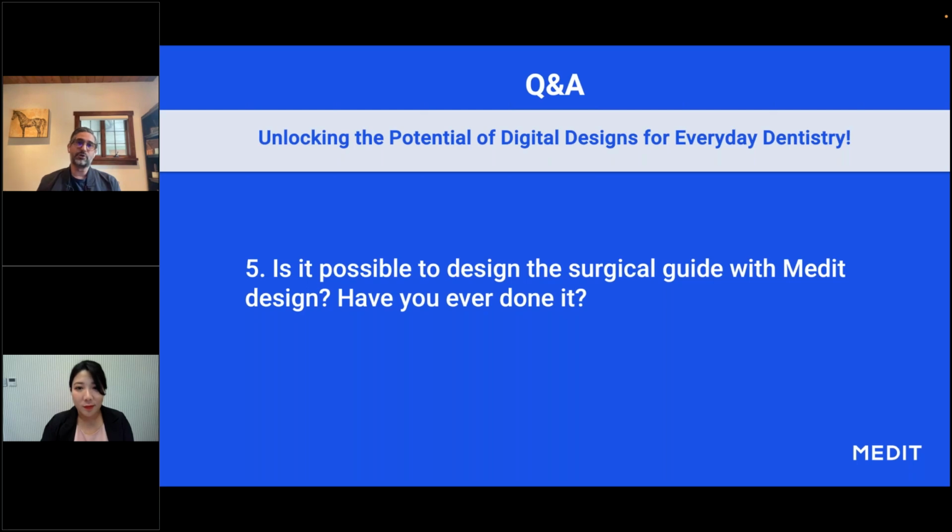But I know that you can make non-sleeved surgical guides with Medit Design. I've watched all the videos. I learned a lot from watching those videos about the different things you can do. For example, I used that as inspiration when I was making an implant provisional without even having the abutment, just using some of the same features and tools to make the screw access opening and everything.